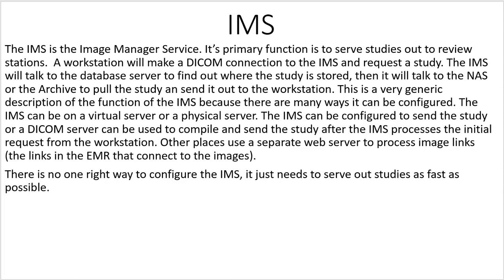IMS. The IMS is the Image Manager service. Its primary function is to serve studies out to review stations. A workstation will make a DICOM connection to the IMS and request a study. The IMS will talk to the database server to find out where the study is being stored, and then it will talk to the NAS or the archive to pull the study and send it out to the workstation.